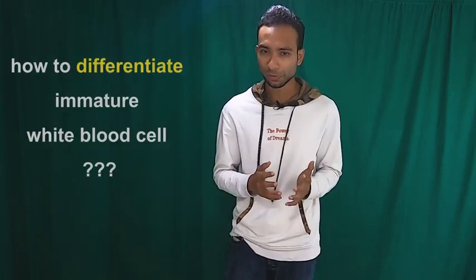Myelocyte. When we talk about myelocyte, it is ovoid in shape and a little smaller than myeloblast. It contains condensed chromatin. Also, nuclear to cytoplasm ratio is low.